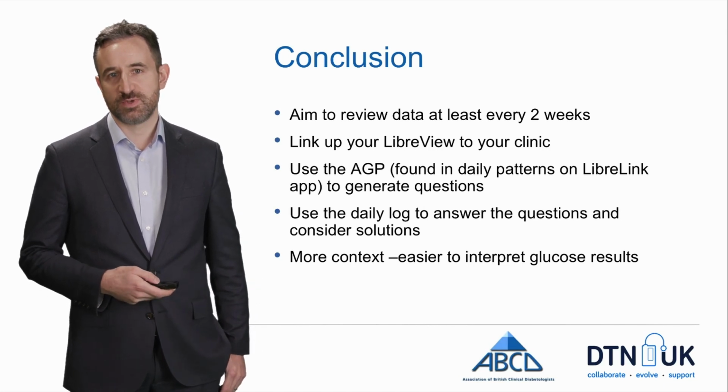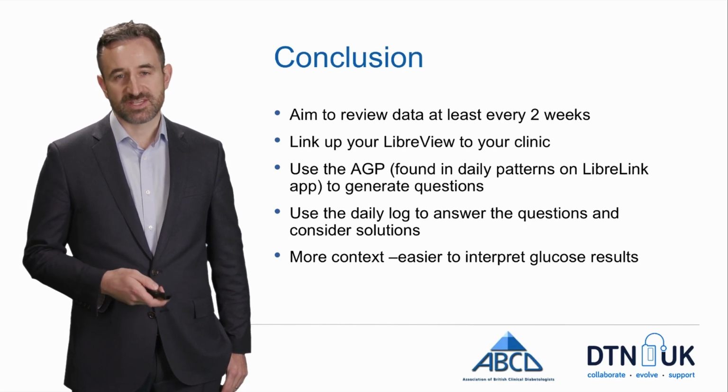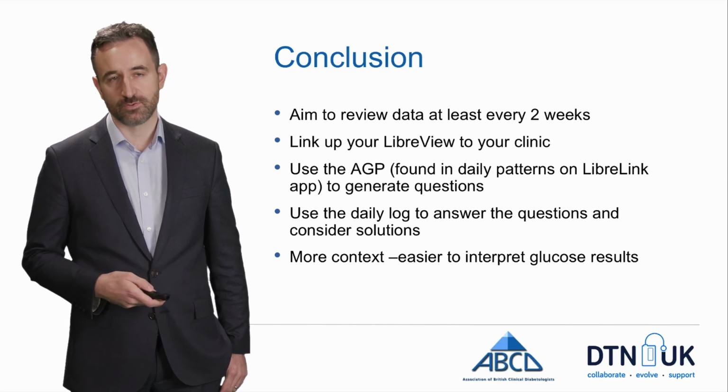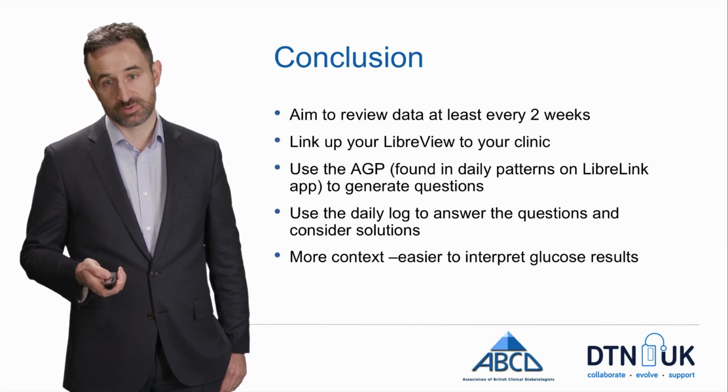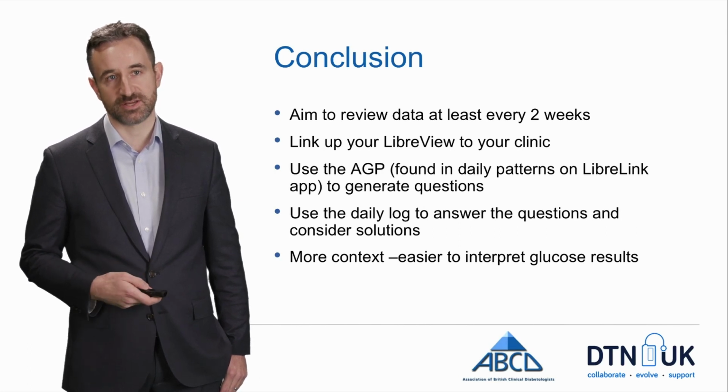We'd strongly encourage people to use LibreView and link up to the clinic that you attend, as it then gives you the opportunity to correspond with your clinic by email or telephone and have your healthcare provider look at your data without necessarily having to attend the clinic yourself.